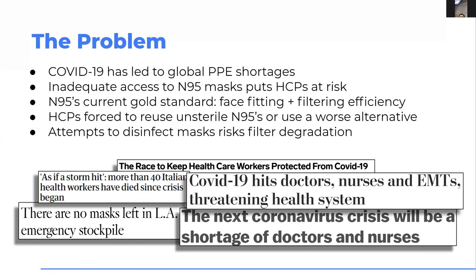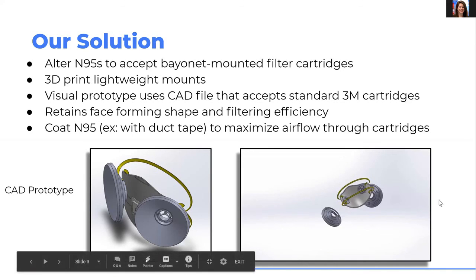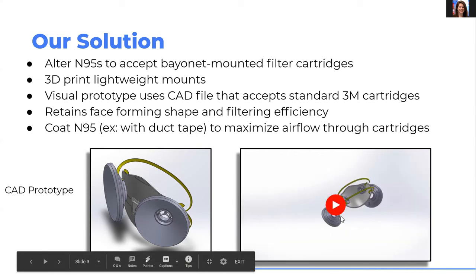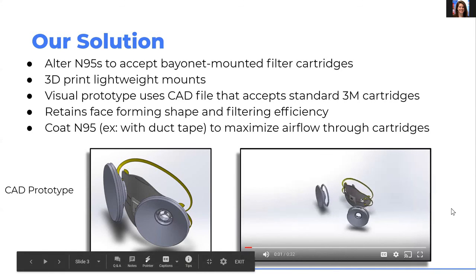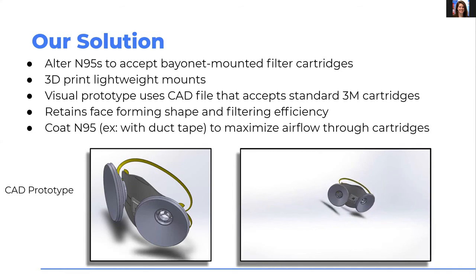So our solution takes advantage of the fact that when N95s wear out, it is the filtration medium and not the face fit that wears out. Our solution takes old N95s, and instead of throwing them away, we coat them with a non-breathable material, such as duct tape, to eliminate the degraded filtration. And then we cut two holes in the mask and slide in 3D printed adapters and silicone rings as seals. And so now that old N95 is essentially a makeshift respirator, and you can attach replaceable respirator filter cartridges.